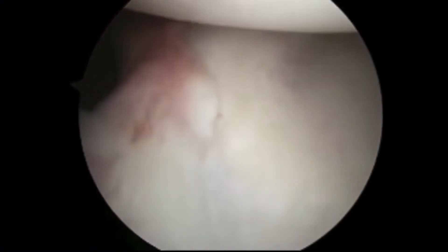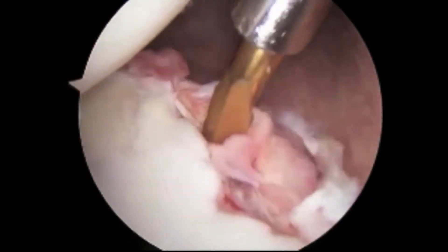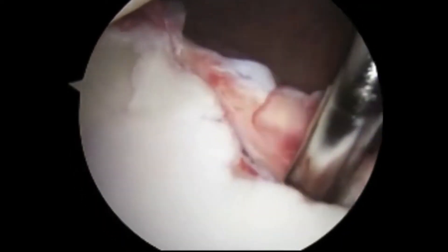Here we have a view of a labral tear or a ligament tear within the shoulder. A probe is used to separate the torn labrum from the bone or the glenoid. This is important so that the labrum can be repaired back to the bone.